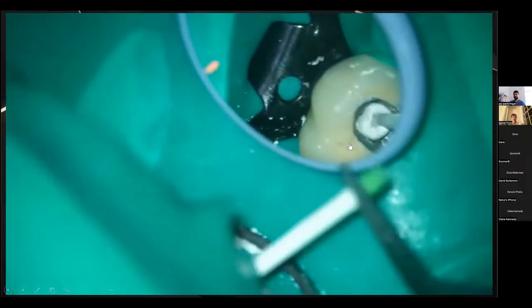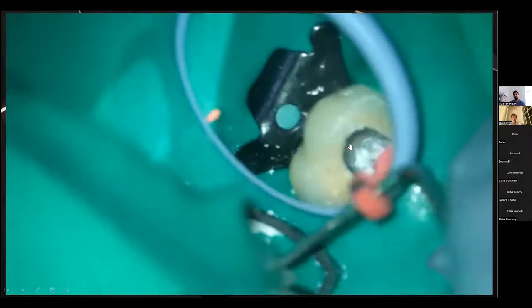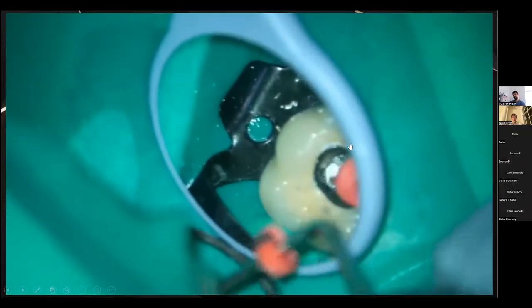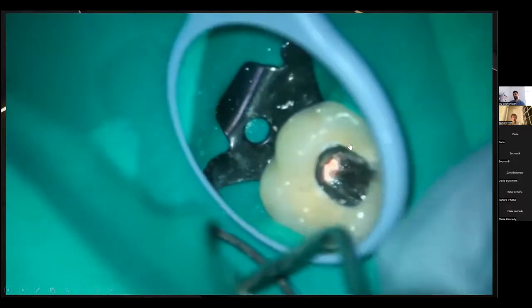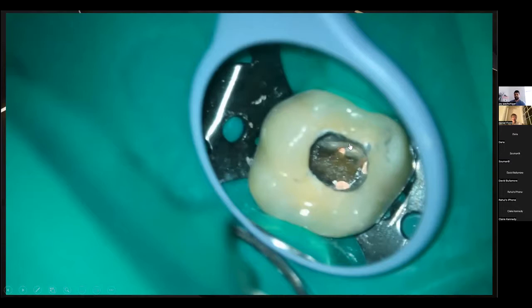You can sometimes use paper points. Paper points are, again, instead of your pluggers, they can be quite useful in packing these type of materials into the canals. And so then once this is done, I will just put a small layer of GP. And so that when I'm cleaning the pulp chamber, all that putty is not getting washed away. It just makes things a little bit easier.